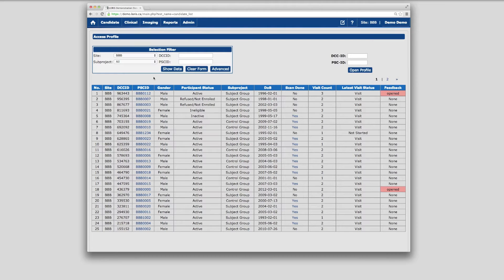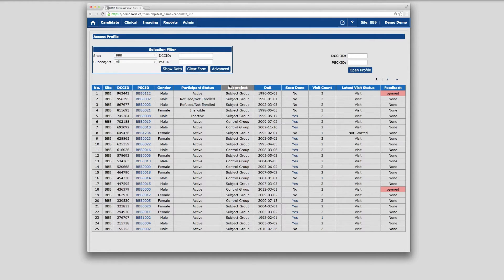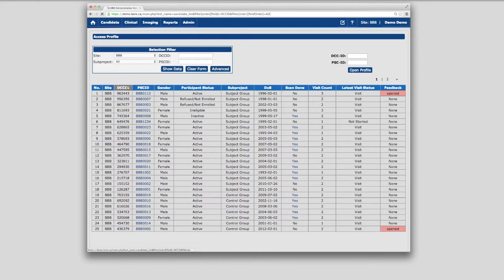This view shows metadata about each subject that can be filtered as well as sorted by any column, such as site, subproject, or subject ID.